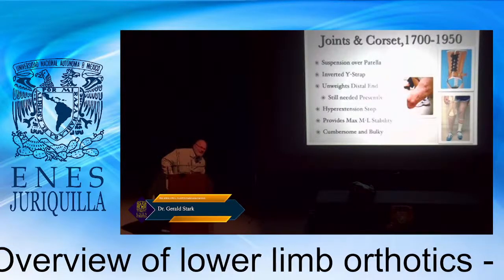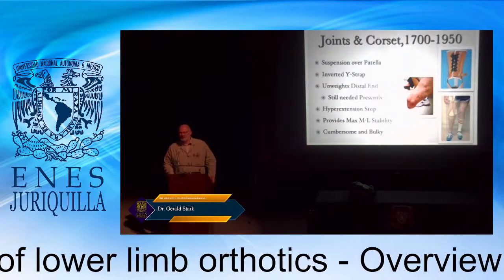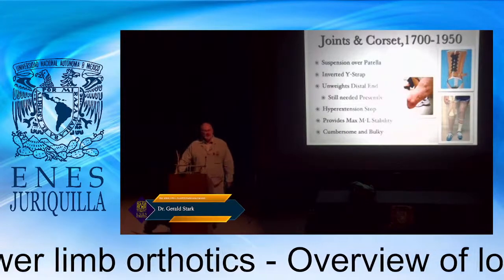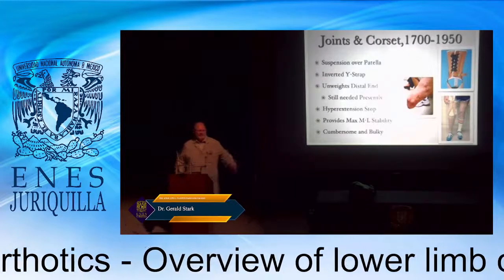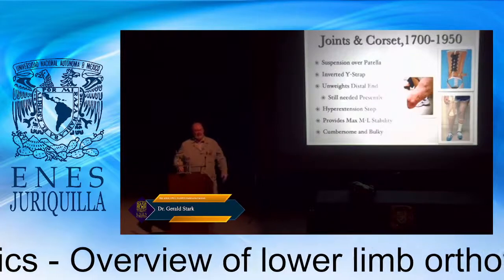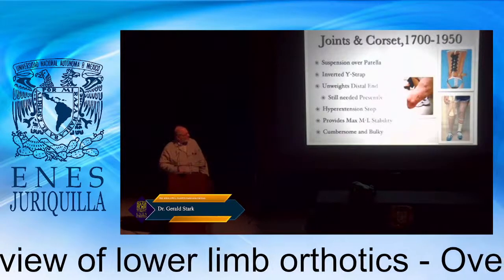Can you find the tibial tubercle? It's really just about maybe 50 millimeters distal from your knee joint. So they really weren't using the knee itself, the leg of the patient, to actually bear weight. They felt that that weight should be supported with the thigh.